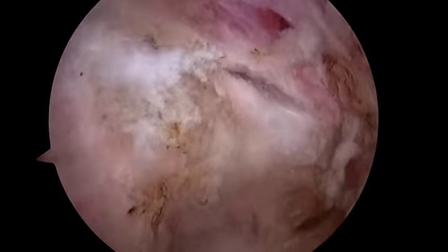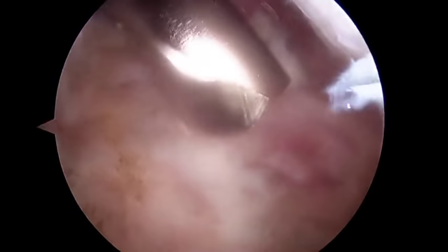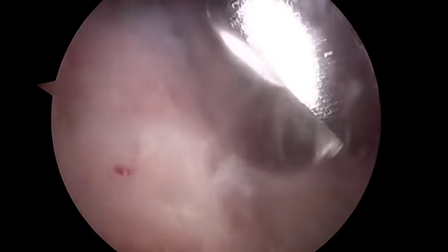And now we're going to use a motorized burr to take down and clean out some of the bone, because the shaver is not able to achieve that. So we identify the edge of the acromion. What we want to do is get rid of some of the spurring and smooth off the bone so we don't have any surfaces that will abrade the rotator cuff. So that's what I'm doing now.